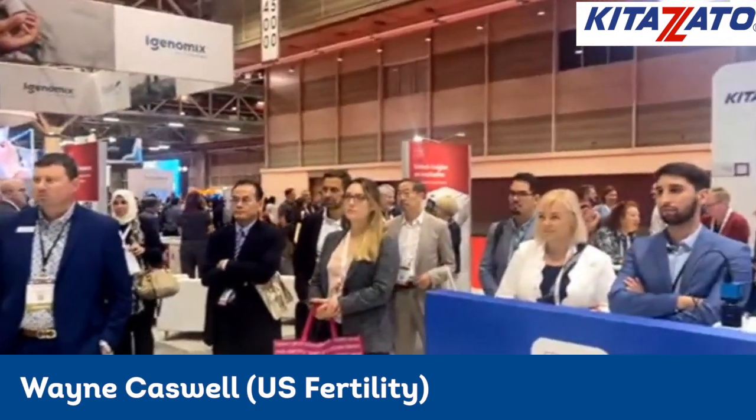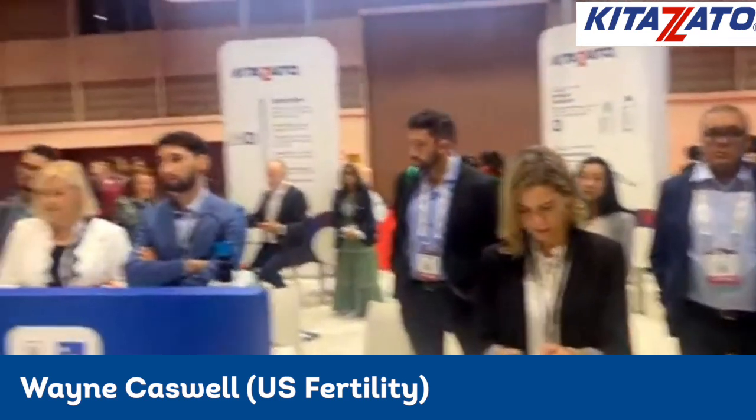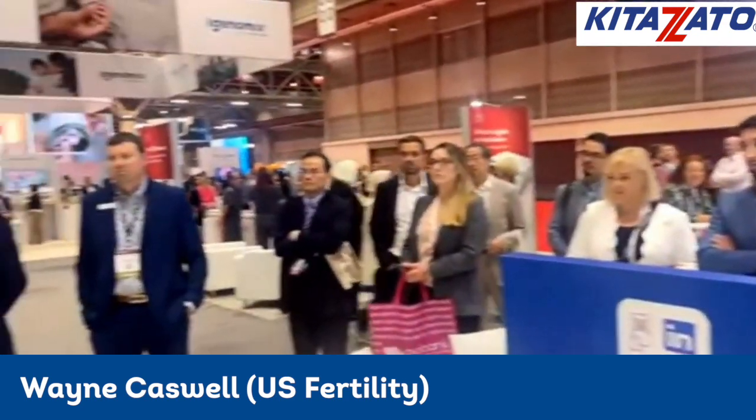There are lots of ways to do this, but you need to look at your own environment, your own experience, and maximize those things. The protocols we'll talk about usually use about 300 microliters, but if I find a laboratory that's in a very dry environment, a larger volume is going to be a little bit more protected. So you need to really look at your unique situation and do things to protect your environment.